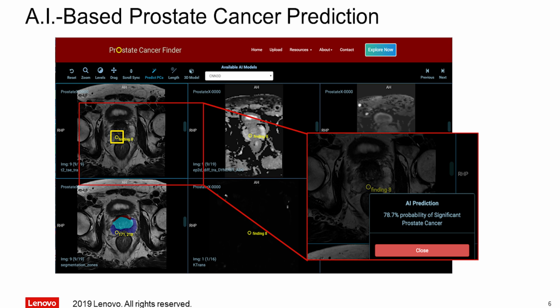And this one is the K-trans image. Because the image contrast is too high to see the details here, they will be easier to see in the live demo, because we can adjust the image contrast levels. And here, when we click the location shown on the tag with finding 8, this is the location where, precisely, the model was assigned to do the prediction.